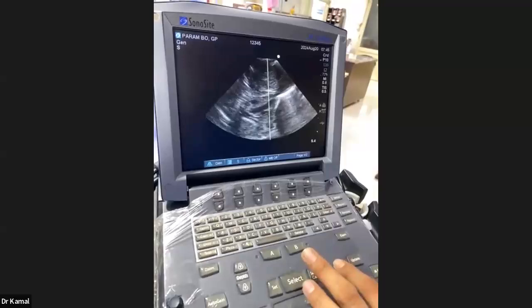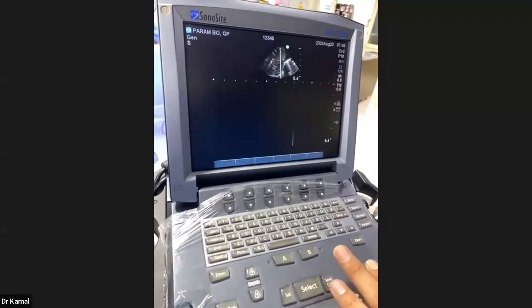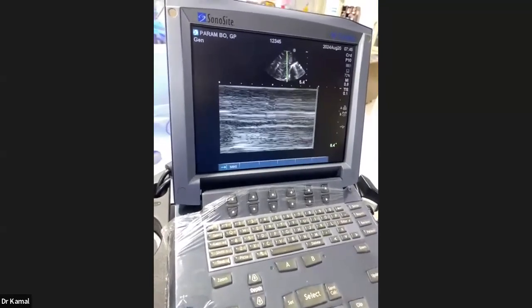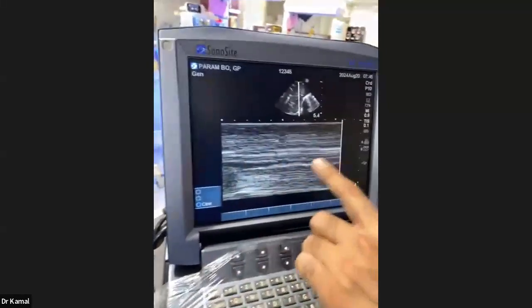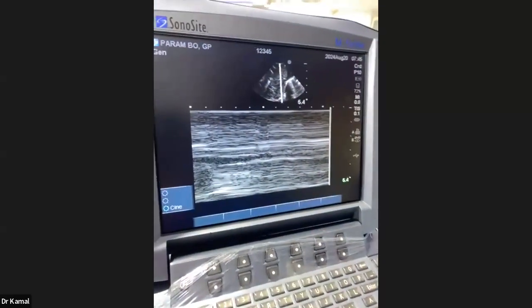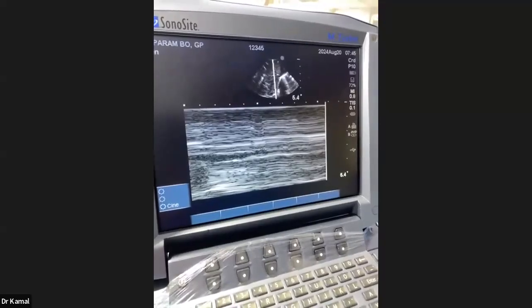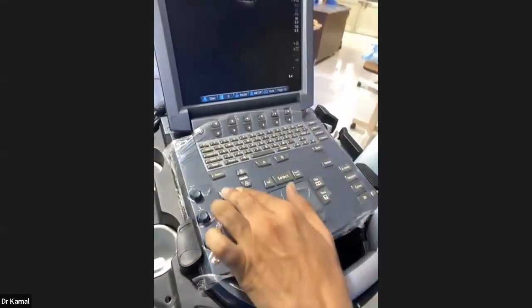I can put it over here and I'll show you. So you can see a line coming over here. This is not a very good image, but you should understand these are the measurements to be done for the IVC, LA ratio, and ejection fractions. I hope I'm clear. So what I was doing in between these modes was trying to set up the gain.